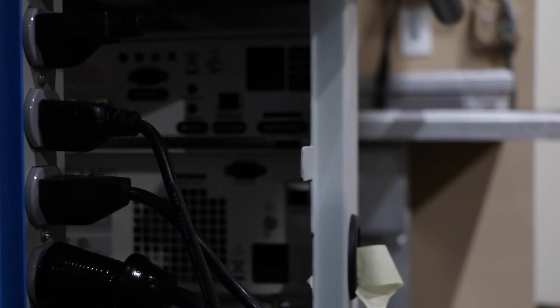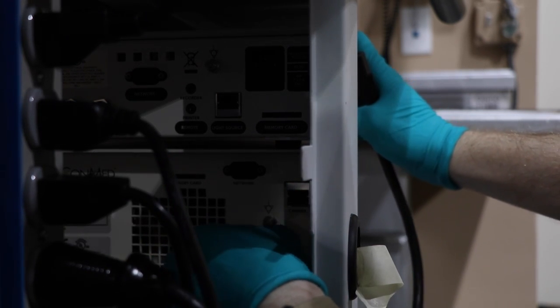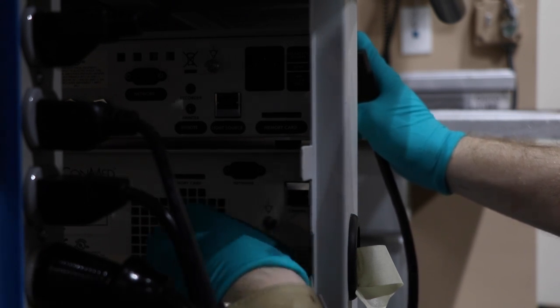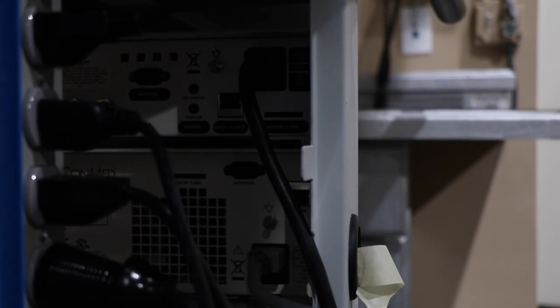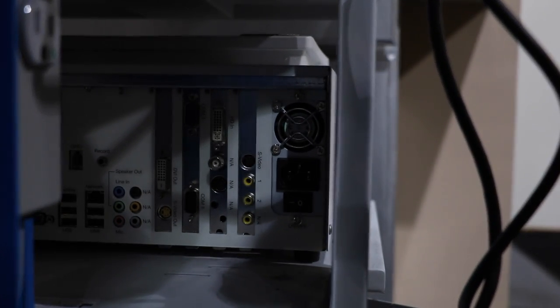We'll take both the power for the IM4000 and the LS7700 and go ahead and plug those in as well. Let's take the power for the DRS-HD and plug it in.